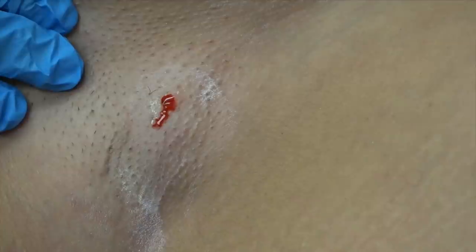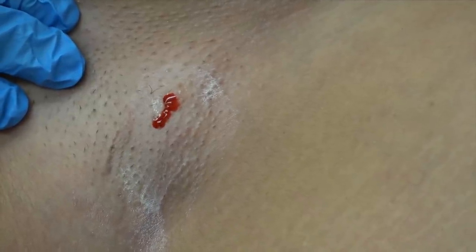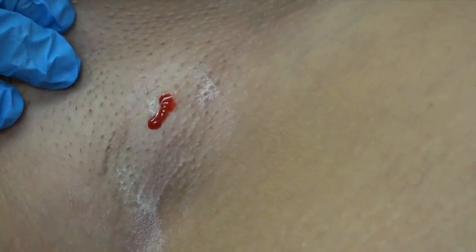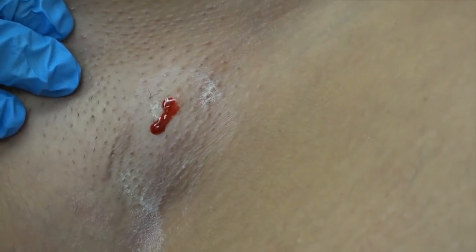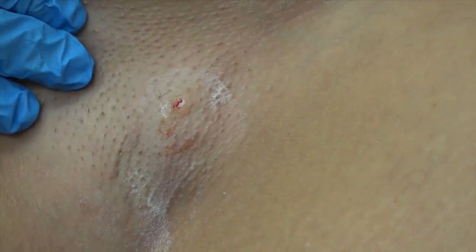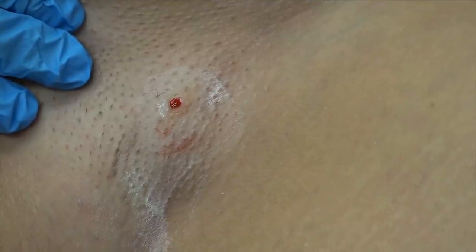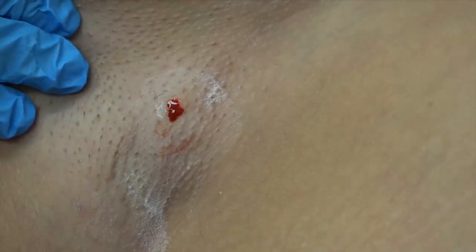Okay, there we go. Now you're going to put a stitch in. Now I'm ready, standing by with my gloves on just in case. Did you give us permission to record this? Yes, you asked me. How long have you had this little skin tag? Forever. Did you name it? No. Are you happy to have it off? Hell yeah. Now it's gone. Now Dr. Gonzo needs to put one stitch.